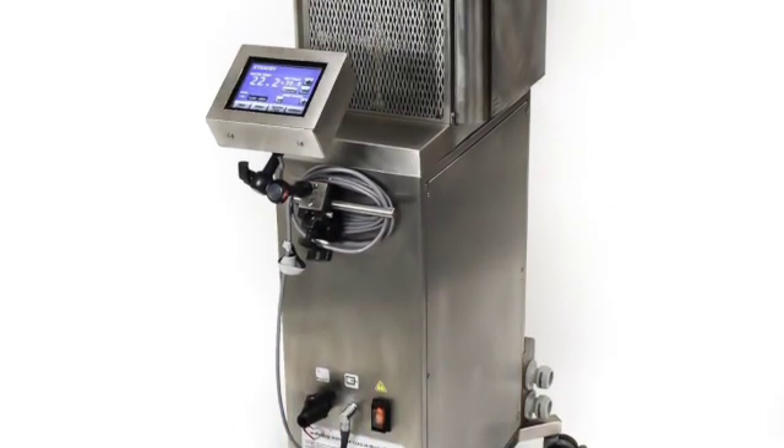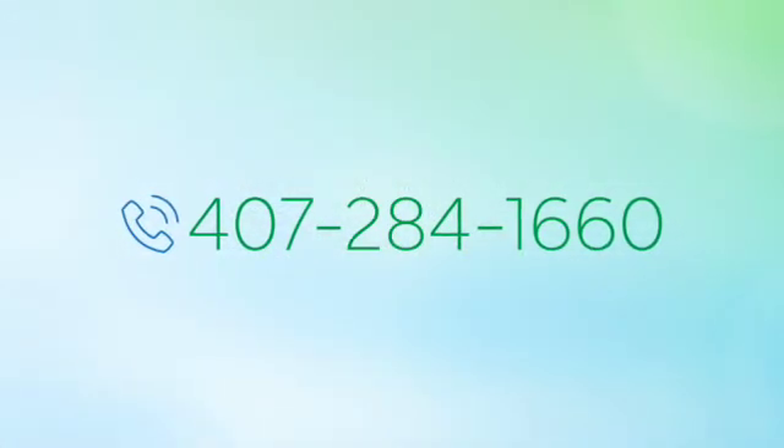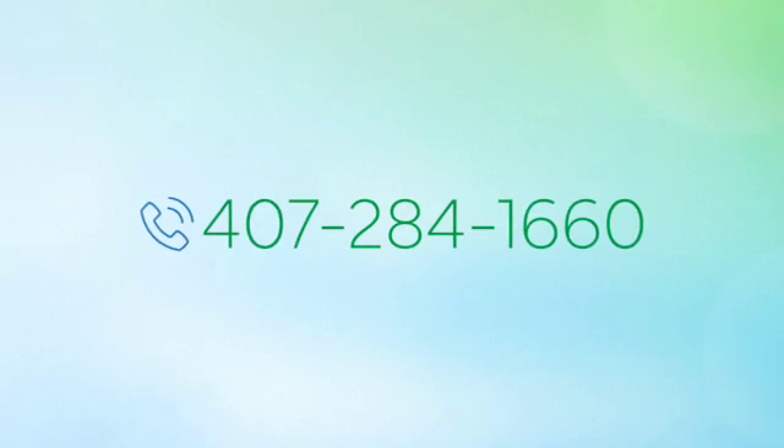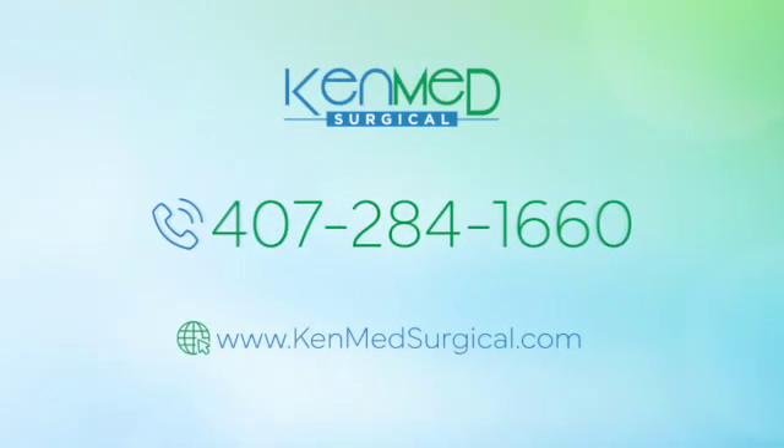All equipment from KenMed Surgical is biomedically certified with documented paperwork. Call today for pricing and availability on a refurbished, patient-ready Cardioquip MCH1000i Modular Heater Cooler from KenMed Surgical.